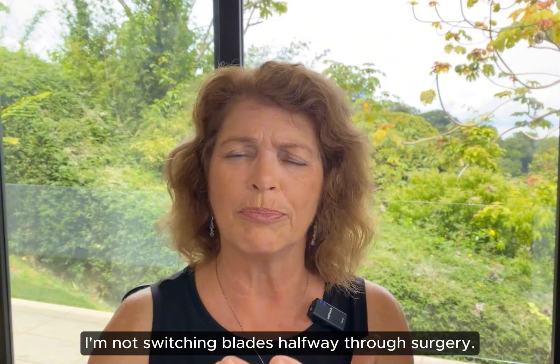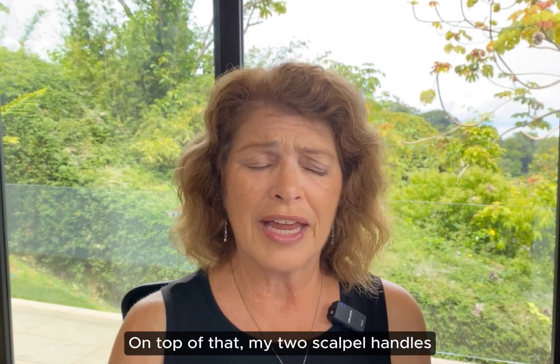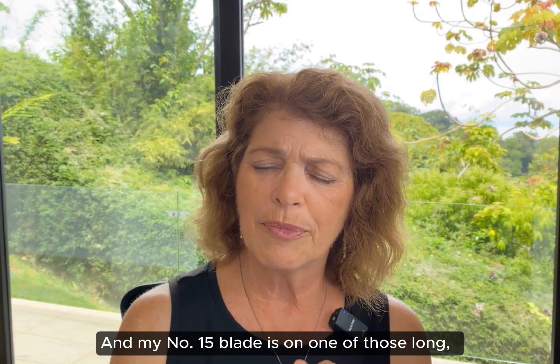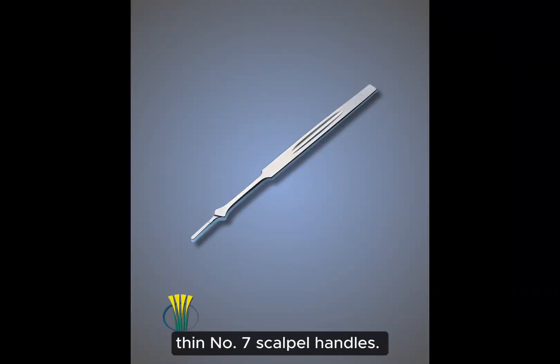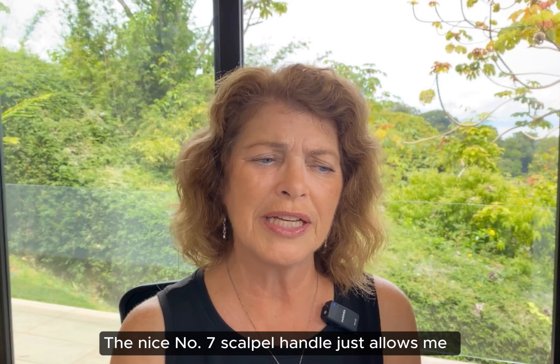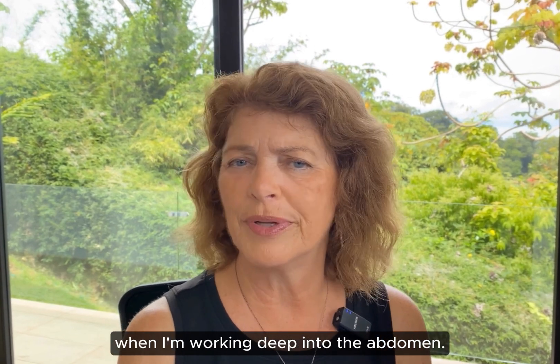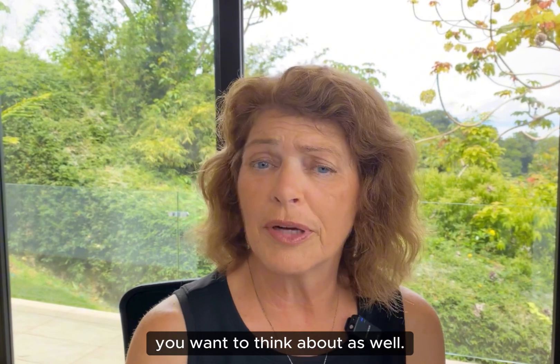I'm not switching blades halfway through surgery. My two scalpel handles look very different. I have the regular Bard-Parker — I think it's a number three that we all tend to use — and I've got my number 10 blade on that. And my number 15 blade is on one of those long, thin number seven scalpel handles. The number seven scalpel handle just allows me a little bit of greater reach for when I'm working deep into the abdomen. So maybe that's something you want to think about as well.